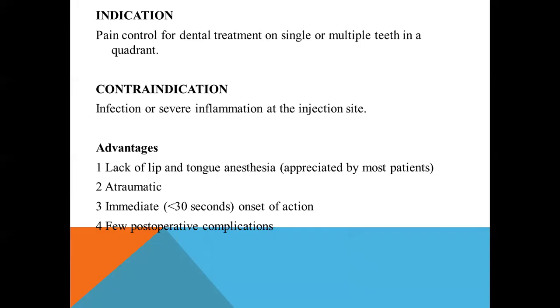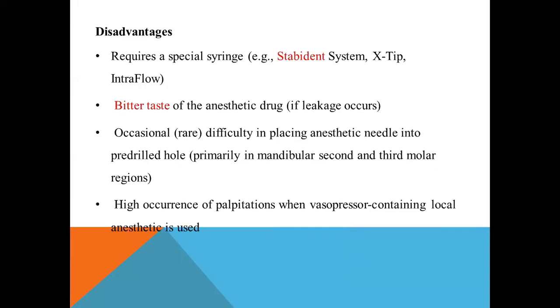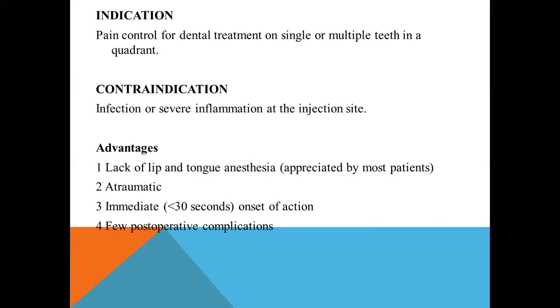Advantages are lack of lip and tongue anesthesia, atraumatic, immediate onset of action, few post-operative complications. Disadvantages: requires a special syringe, which is called Stabident or X-Tip IntraFlow. Bitter taste of anesthetic solution. Occasionally difficult in placing the anesthetic needle into the perforation hole. High occurrence of palpitation when a vasopressor-containing local anesthetic is used.